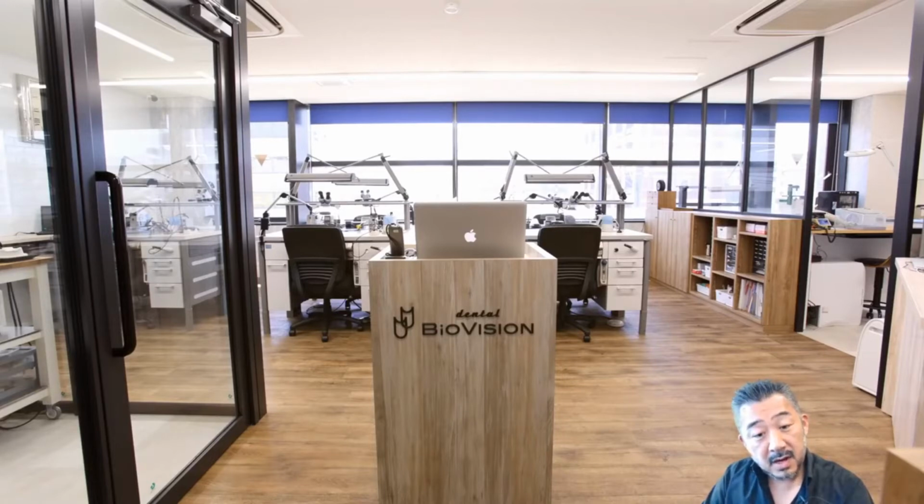And the main one is the monolithic zirconia. I expect the use of monolithic zirconia will increase with the spread of the IOS, right? Therefore, today I'll explain the design, the processing, and the color control of monolithic zirconia crowns from the front teeth to the molars.